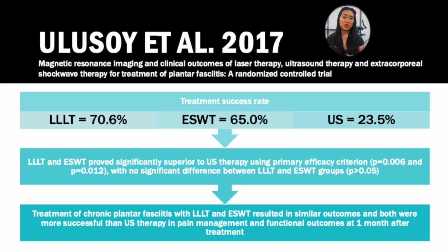Based on this information, Ulusoy and colleagues concluded that both laser and shockwave therapy proved to be significantly superior to ultrasound therapy, but there was no statistically significant difference between the laser and shockwave therapy groups for the treatment of chronic plantar fasciitis to help with pain management and improve functional outcomes 1 month post-treatment.